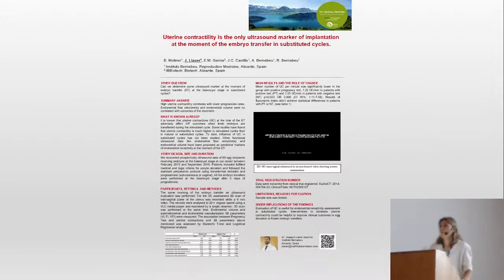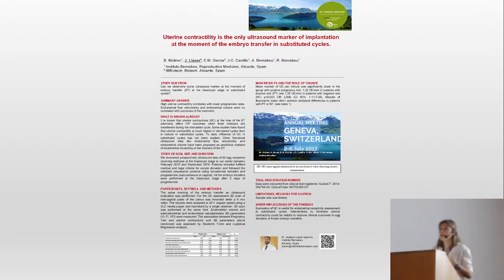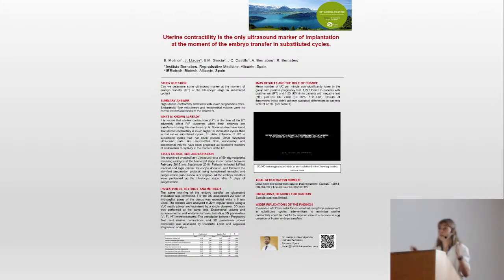So I would like to tell you the history, why we are interested in that. In 2016, one of the companies that developed one of the oxytocin antagonists contacted us, and they showed us how to perform the ultrasound of contractions: recording a video of 6 minutes, then accelerating it. Okay, so we started that, but finally we didn't participate in this study.